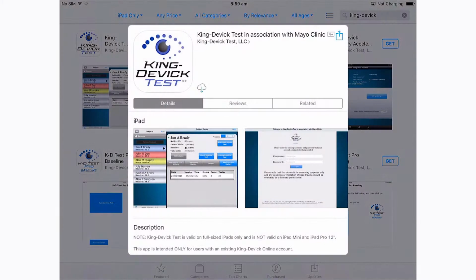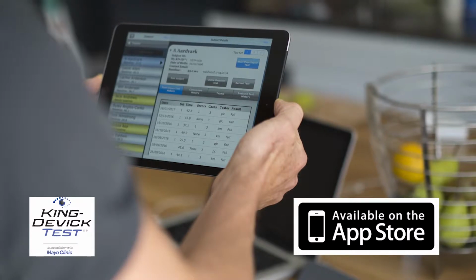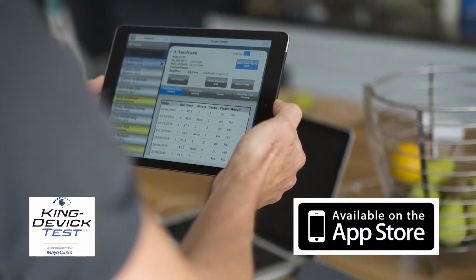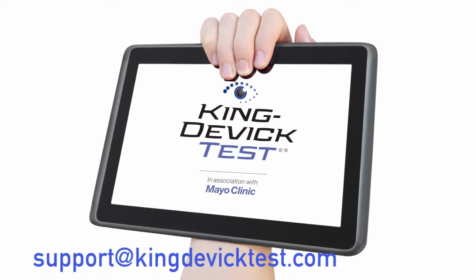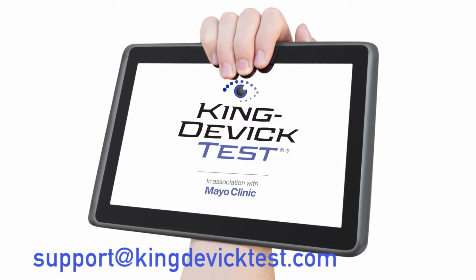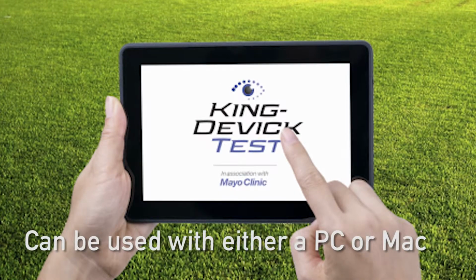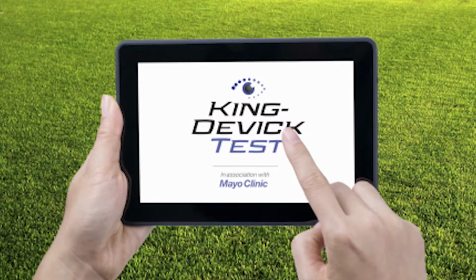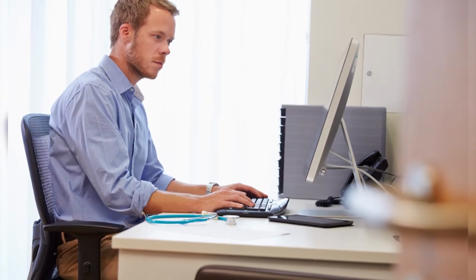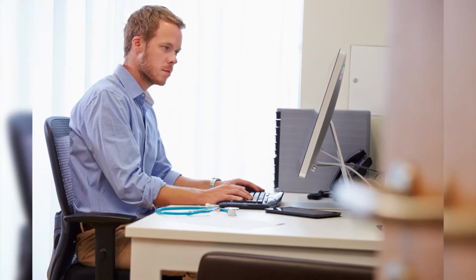To use the King-Devick test, you must first download the app from the iTunes store, and it can only be used on a full-sized iPad, not the iPad mini or iPhone. The King-Devick test app is also available for 10.1-inch Android tablets with minimum system requirements. If this is your first time using the app, you'll be prompted to register with an email and password.